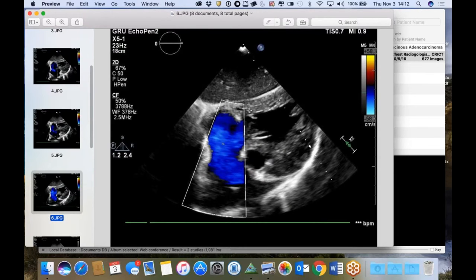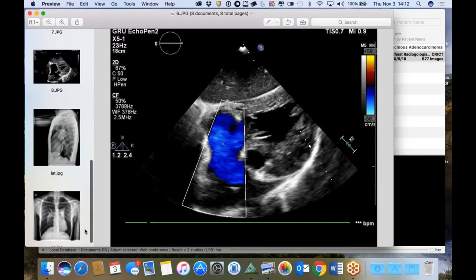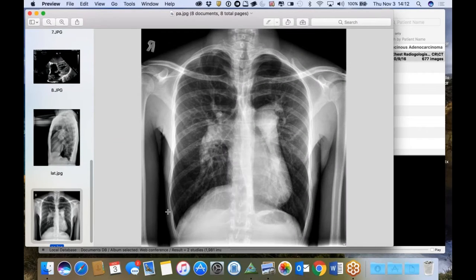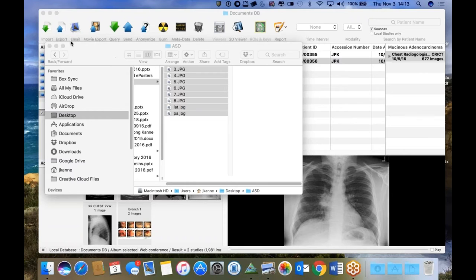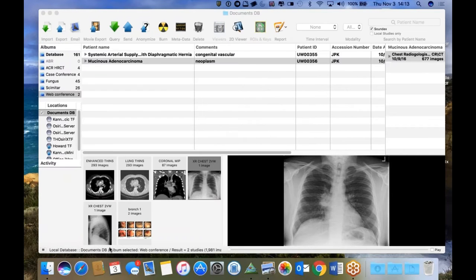So this is an Eisenmenger - a really bad ASD that had gone unrecognized for some time. I don't have all the details in front of me, but I'll send this along as a really nice case. That's all I have this week.